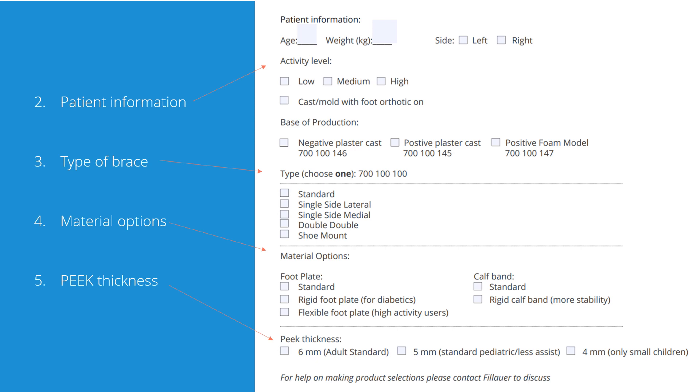In the next section, you choose what brace model you want, and below there are some options regarding materials. For the foot plate, you can choose between a standard, rigid, or flexible layout. The most important thing to remember is that to increase durability of the foot plate, the flexible layout is the best — especially important for high-activity users. The rigid alternative is an option, but personally I would choose a more rigid shoe and maybe an insole if I needed to distribute plantar pressure more evenly. For the calf band, you can choose either standard or a rigid layout depending on the need of the patient. You can also choose peak thickness.